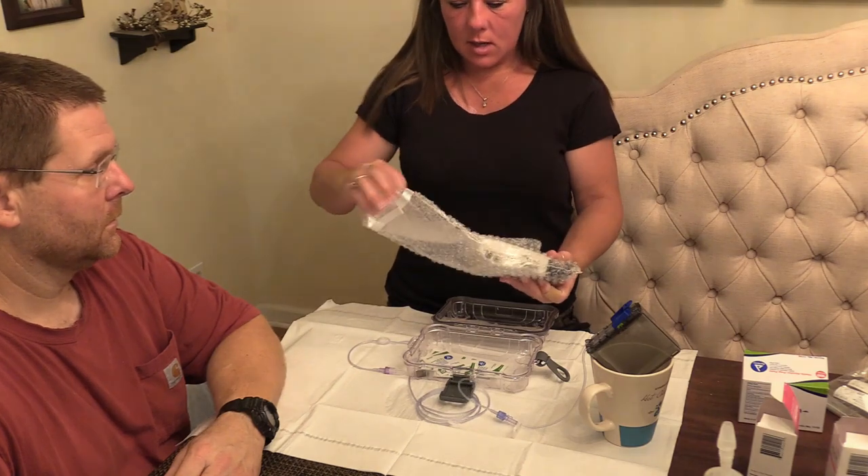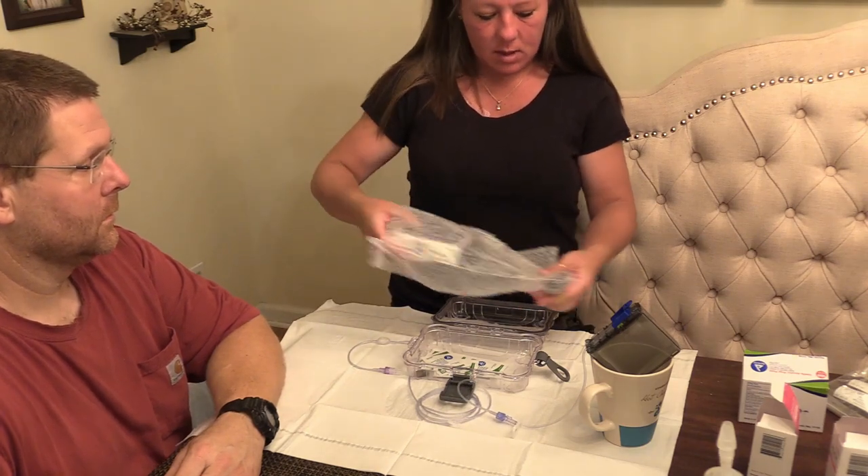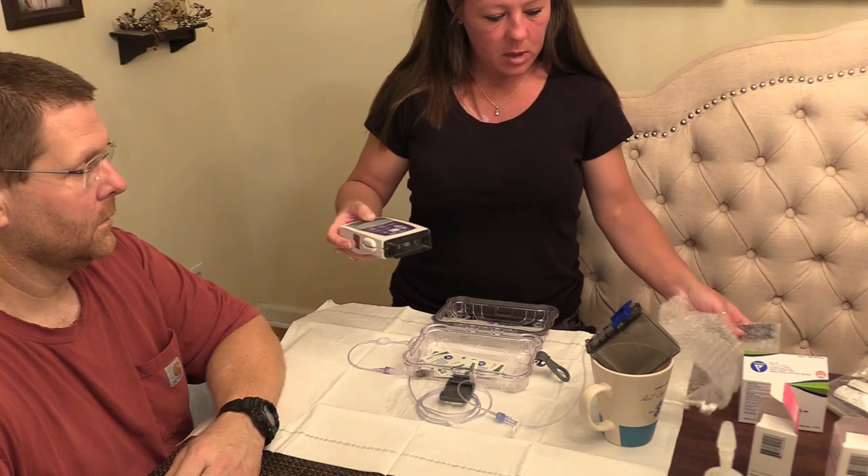This is the packaging that one of the pumps came in — we just keep it in there to keep it protected.